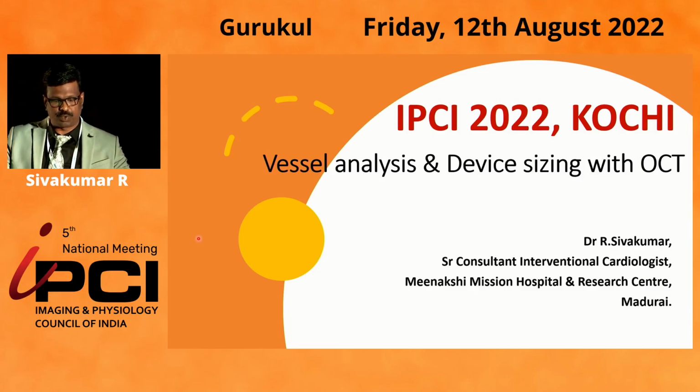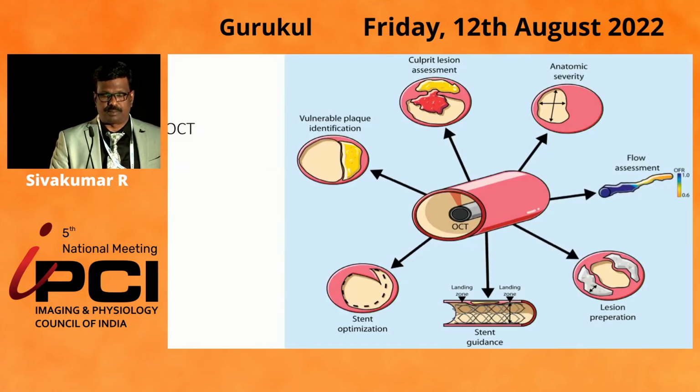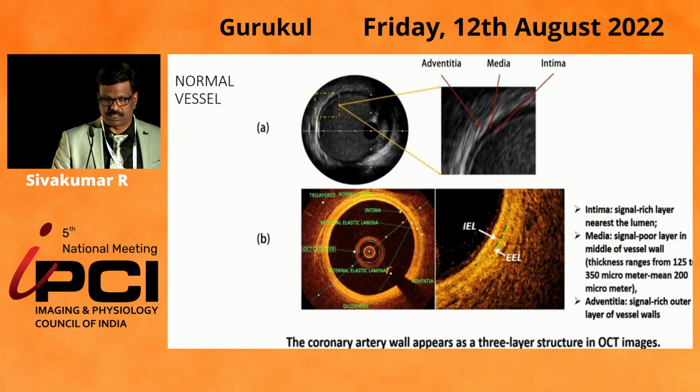Basically, I need to take you all through vessel analysis and device sizing with OCT. I think with the discussions already, some preamble was set in. This was shared by Nikhil Prachure, so let me skip this.